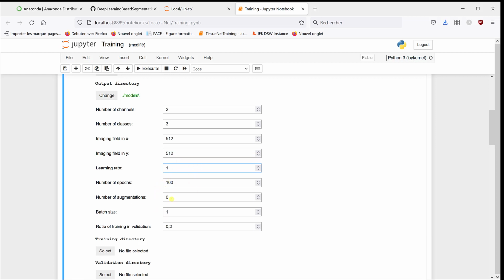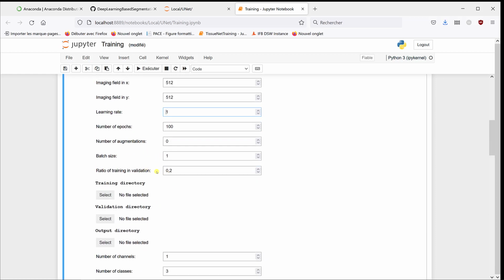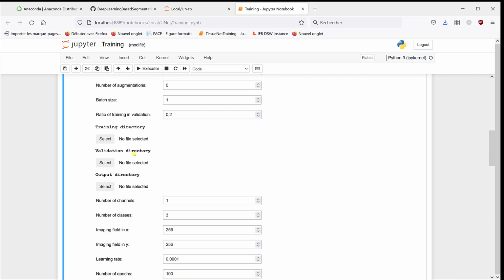for 100 epochs. No limitation, we'll try that later on. And so this is not used. We could increase the batch size. I won't do it just to make sure that it's going to run on our GPUs. It would be faster. Sometimes it improves the accuracy a little bit as well. But we'll stick with it.